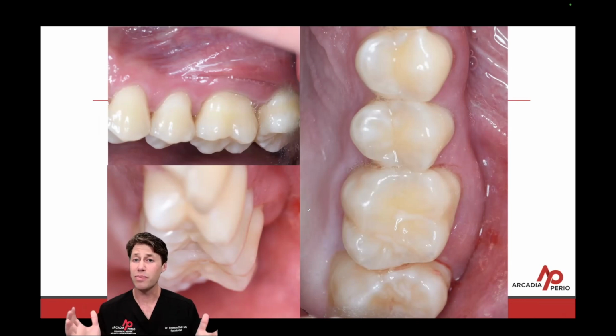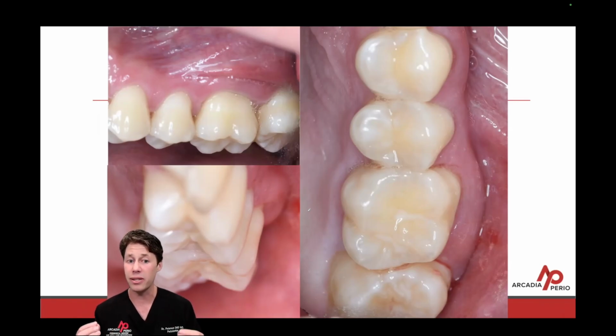So now that I've given you some background information, I hope that was helpful in providing a good foundational knowledge so you can better understand this case here. This is a case that I have really enjoyed treating, and I've really enjoyed following this case up for over 2 years. So the patient presents a younger male, I think 26, 28, somewhere in that vicinity, ASA1, no systemic issues.